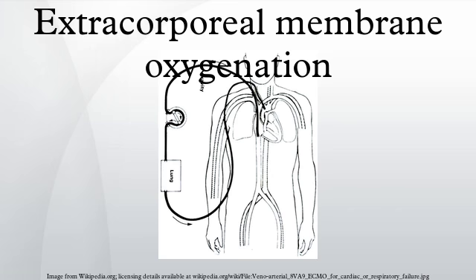In VA-ECMO, patients whose cardiac function does not recover sufficiently to be weaned from ECMO may be bridged to a ventricular assist device or transplant. In infants aged less than 34 weeks of gestation, several physiologic systems are not well developed, especially the cerebral vasculature and germinal matrix, resulting in high sensitivity to slight changes in pH, PaO2, and intracranial pressure.